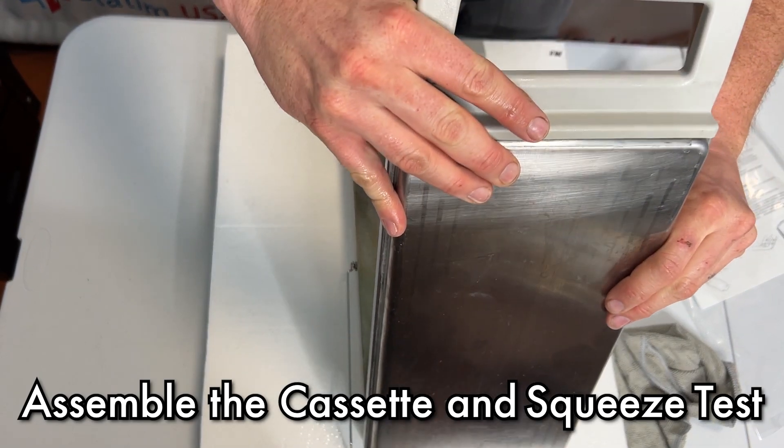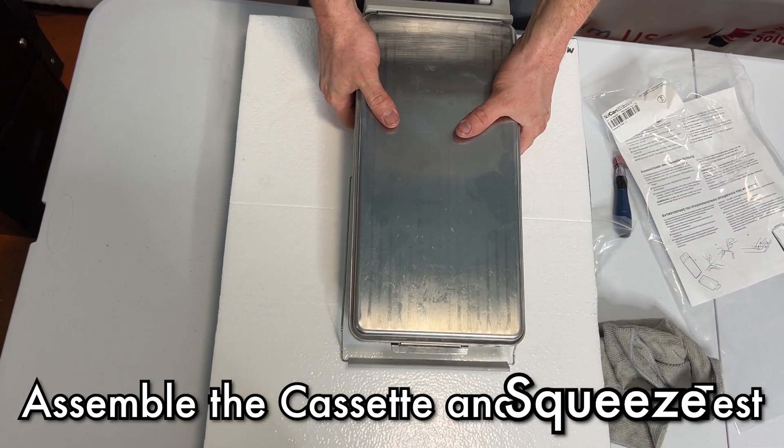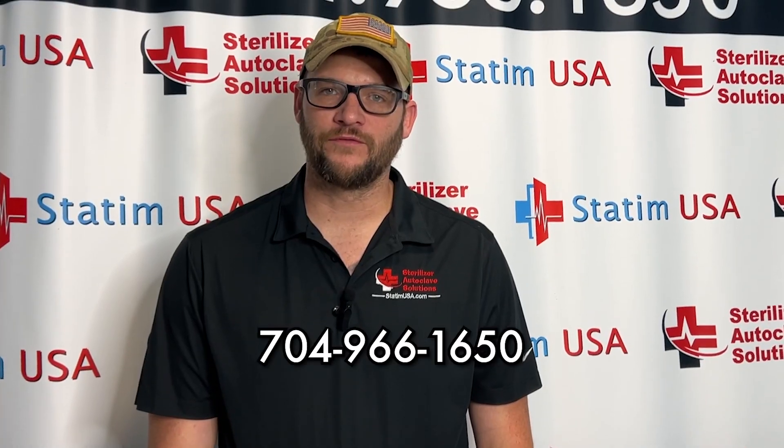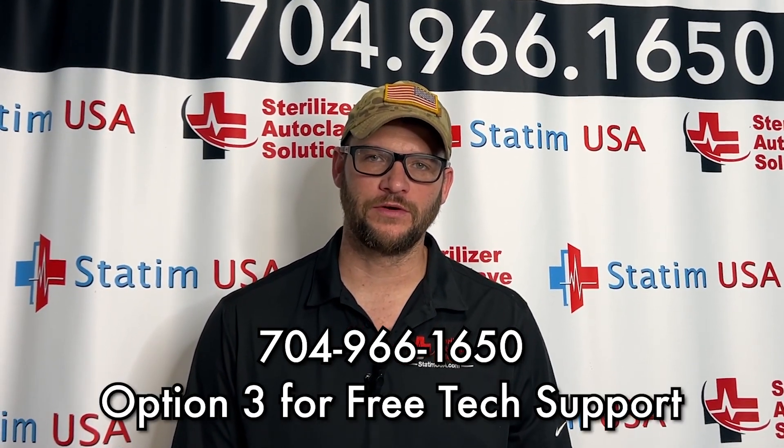The last thing we're going to do is put the cassette back together. You should get a good squishing sound as the cassette goes together. If you have any questions, please give us a call at 704-966-1650, option 3 for free tech support. Thank you.